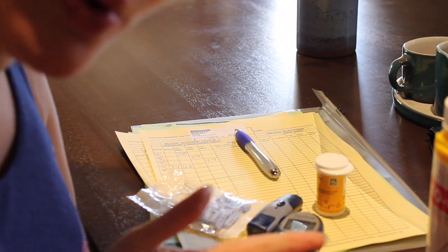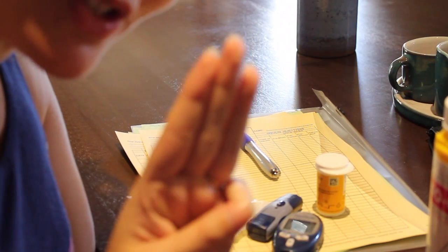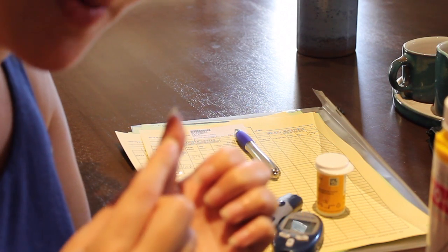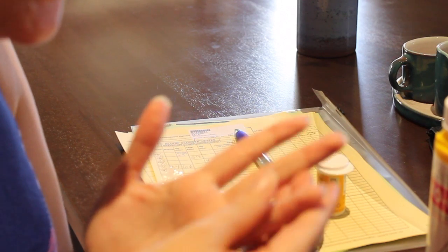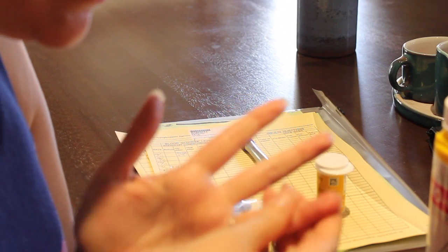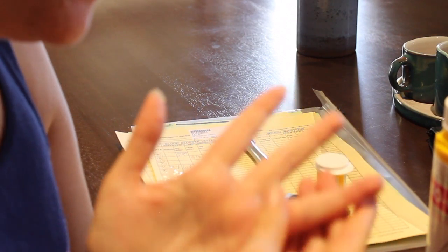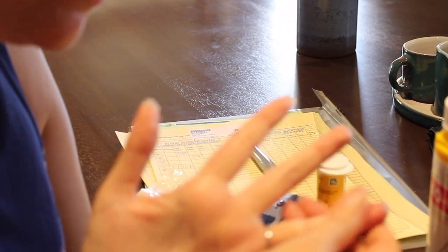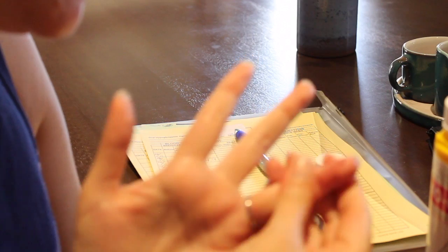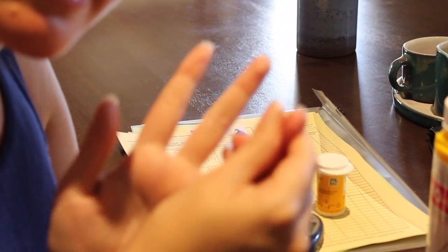So before you set up to prick, all right, I am choosing this finger. They recommend these 3. I have to do it 4 times a day though, so I'm also going to throw in good old thumb here for posterity. So I'm using my left ring finger for my post-lunch reading here. So I am rubbing vigorously from bottom to top to bring, obviously, the blood flow as far to the pad as possible. You don't have to do this too long, and you'll be able to feel once you're nice and toasty.